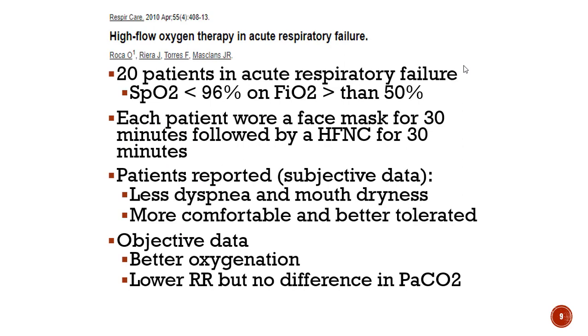This is just a quick little article where they were comparing patients wearing a high flow nasal cannula to patients wearing a high flow concentration mask. The patients, and this is more like the subjective data, reported less dyspnea and mouth dryness with the nasal cannula, and the nasal cannula in general, which is not shocking, was more comfortable and better tolerated.